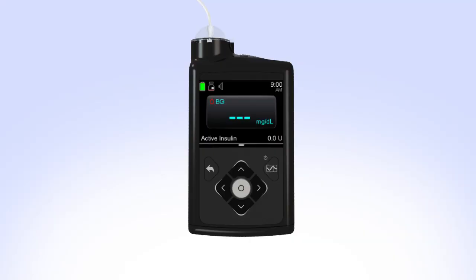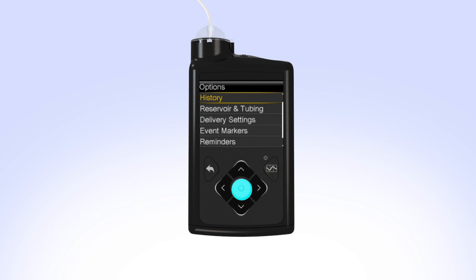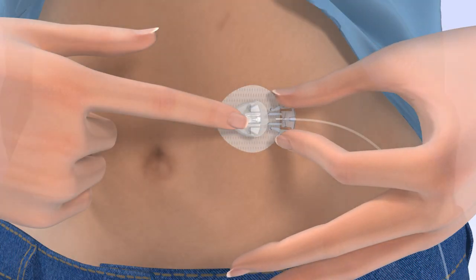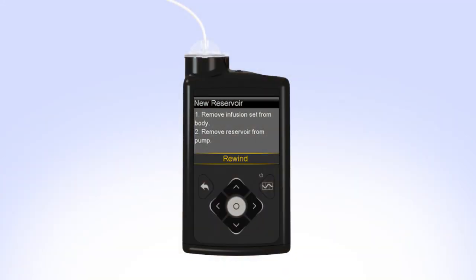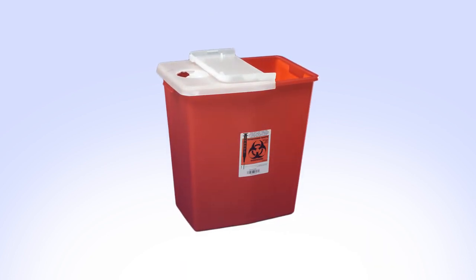To begin, press Select, then press down to Options and press Select. Select Reservoir and Tubing and press Select. Select New Reservoir. The pump will instruct you to remove the infusion set from your body and to remove the used reservoir from the pump. Remove the infusion set you are currently wearing, then remove the reservoir by turning the tubing connector a half turn counterclockwise. Safely dispose of the used infusion set and reservoir.